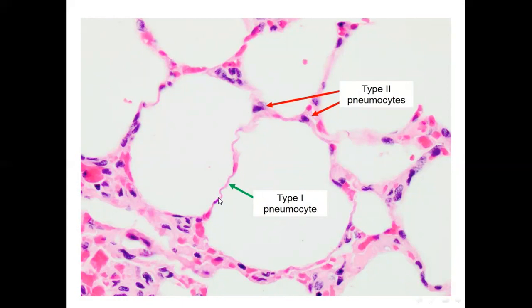Simple squamous epithelium. تمام هذه هي. وممكن we can call it type 1 pneumocyte, type 1 alveolar cell, or squamous alveolar cell. زين. التايب 2 pneumocyte واللي ممكن we can call it a great alveolar cell or septal cell ممكن نسميها, or we call it also a type 2 alveolar cell. تمام, which constitutes about 5% of the alveolar surface but is more numerous than the type 1 pneumocyte.